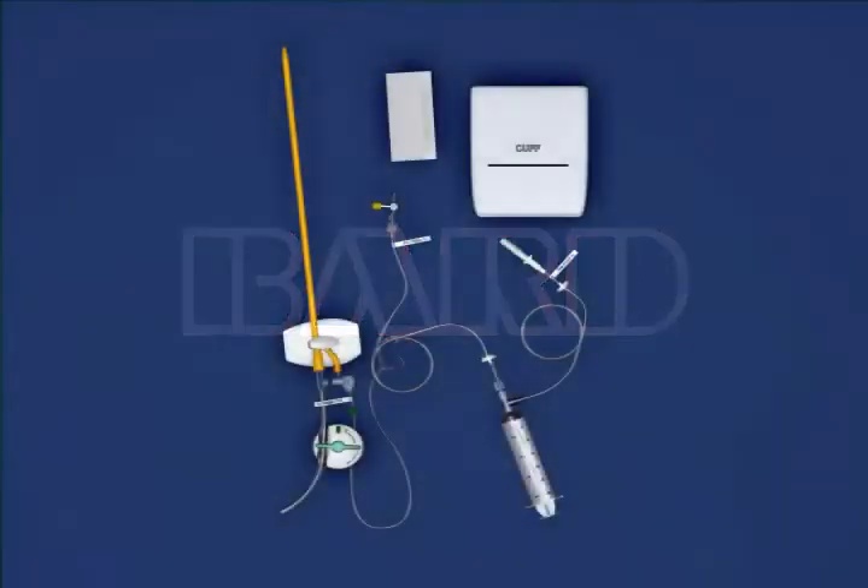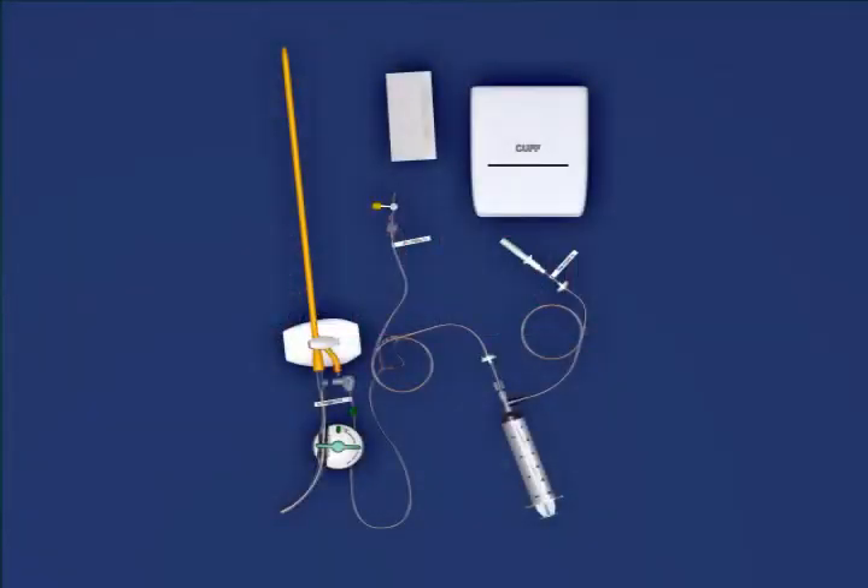The Bard intra-abdominal pressure monitoring device is composed of a tubing set used for infusing fluid into the urinary bladder. It is designed for use with Bard Foley trays with easy-lock sampling port.